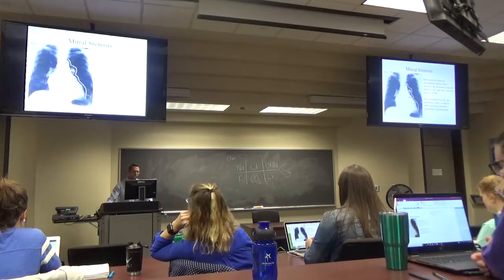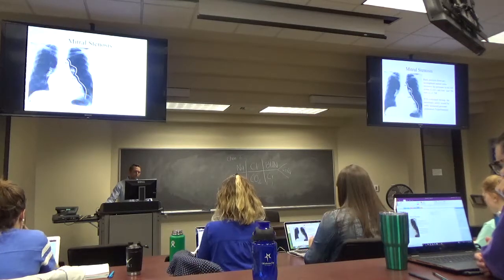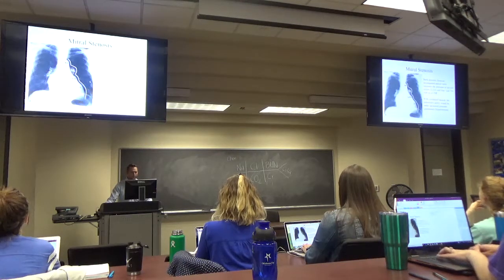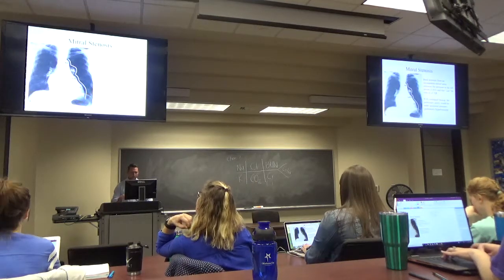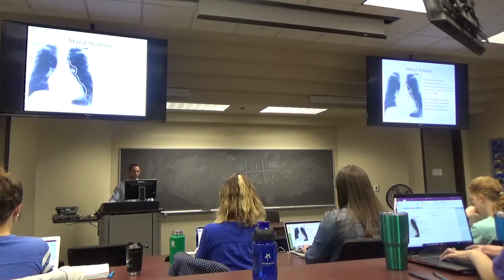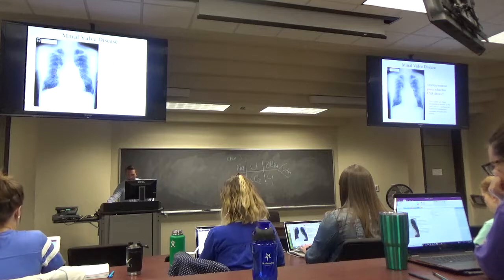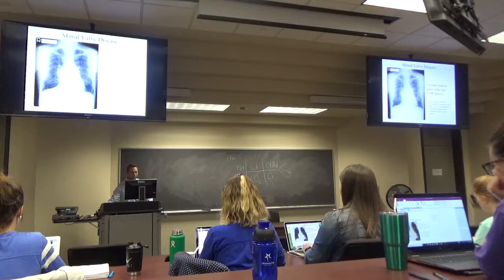You don't normally see a bump for your left atrium like you do in this picture. So you could say that this left atrium is a little enlarged. The pulmonary artery, you can't really say too much about that, honestly. But in mitral stenosis, one thing to note is the heart is not too big. It's upper limits of normal most of the time, not massively enlarged. This is another depiction of left atrial enlargement right here.